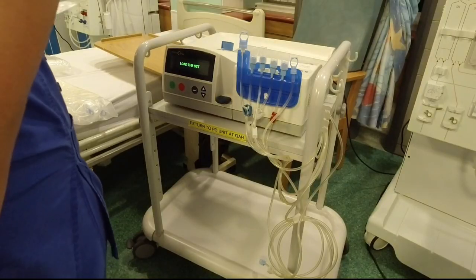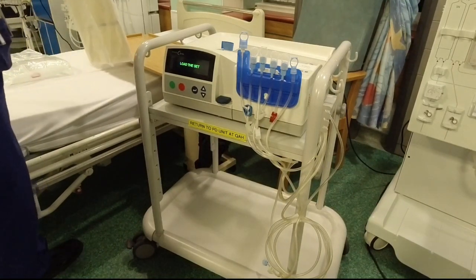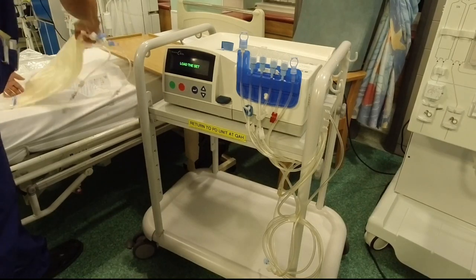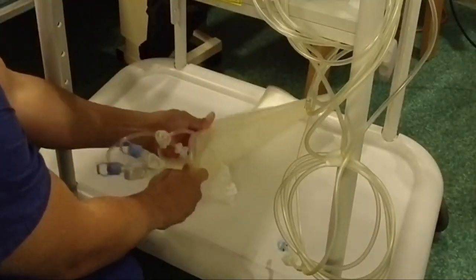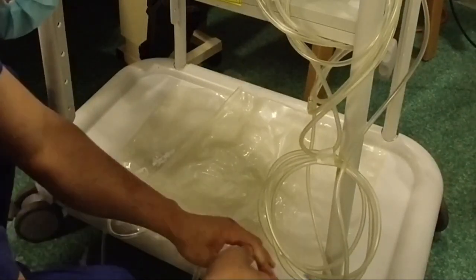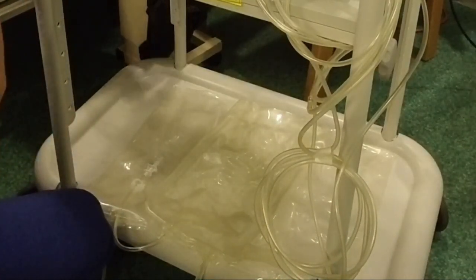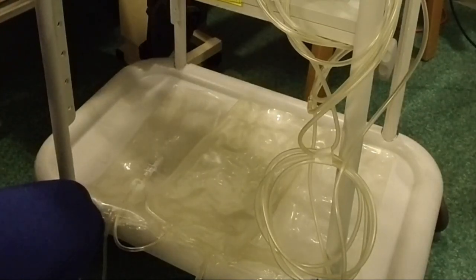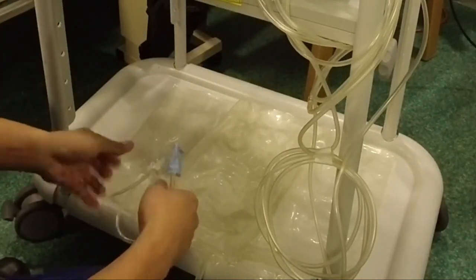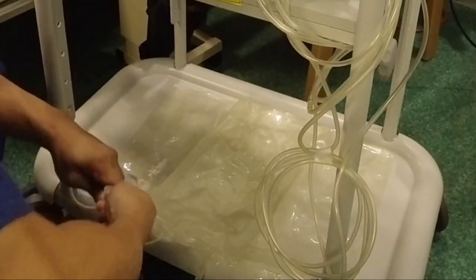Next one is the drain bag. The drain bag goes under here. Make sure you clamp this. Then you get your Y connector. Your Y connector goes to your drain bag, one for each one.